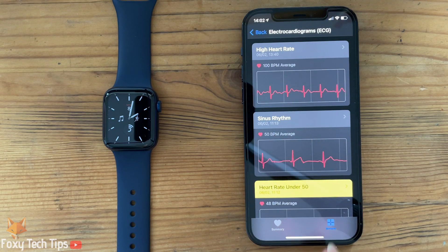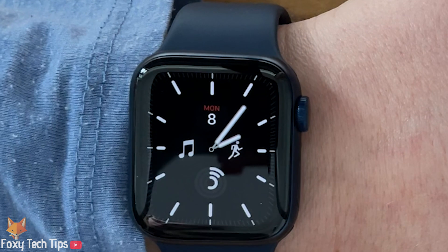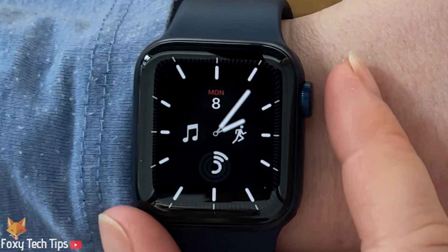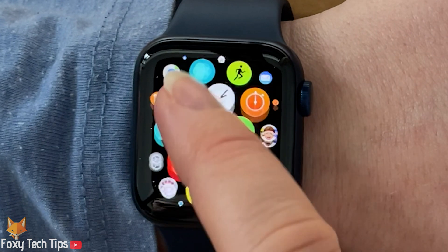You should now get a prompt to set up ECG on your watch. I have already done it so I can't show it again. Once that's done, the ECG app will now be installed on your watch — find it in the app menu.